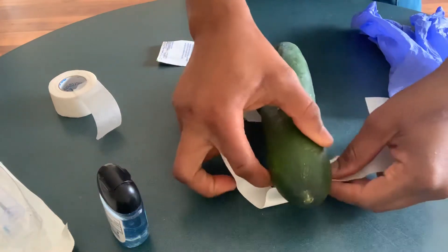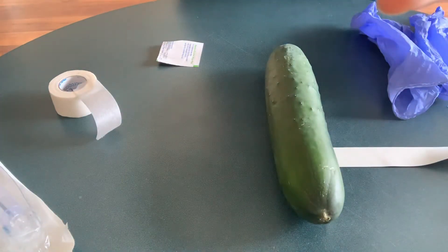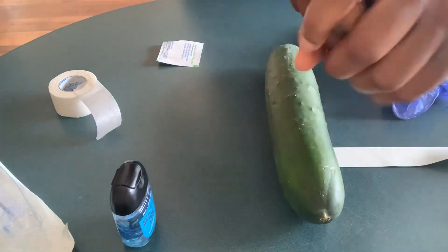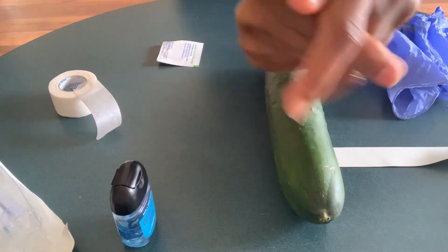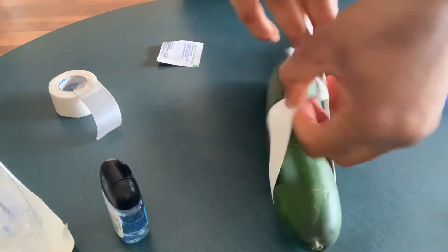So today I'm going to start first and foremost by using my hand sanitizer. Then I'm going to apply the tourniquet first.